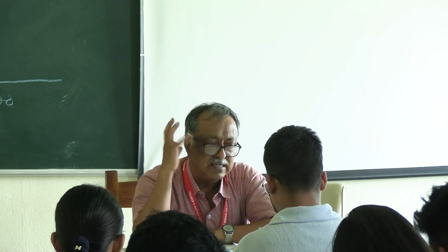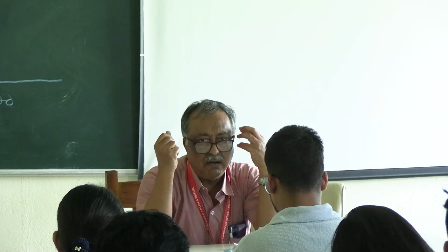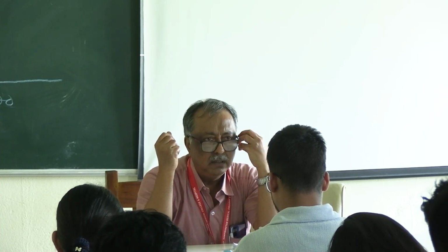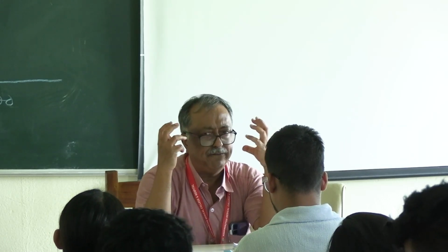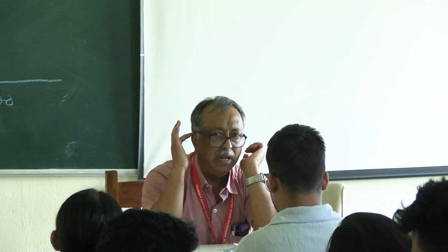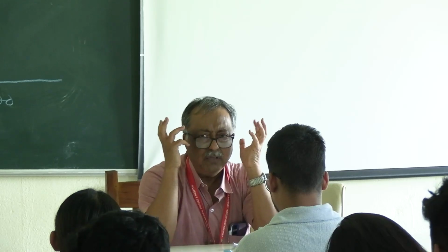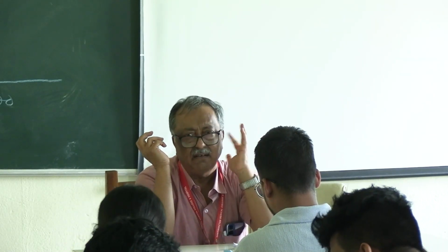Masking of an ear. Suppose you are testing the right ear, and it is profoundly deaf. The sound will transmit to the normal ear, this side. But how can you then assess or evaluate that ear?